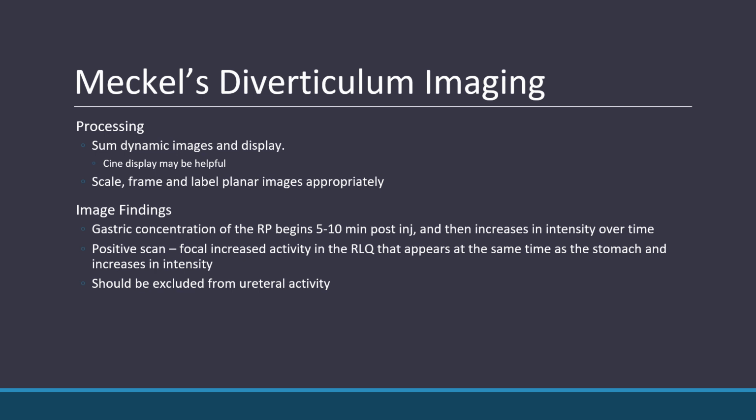And then you'll scale them and label them appropriately. A lot of times you'll send that cine image to the doctor so the doctor can actually see it in motion, and you'll scale, frame, and label them.